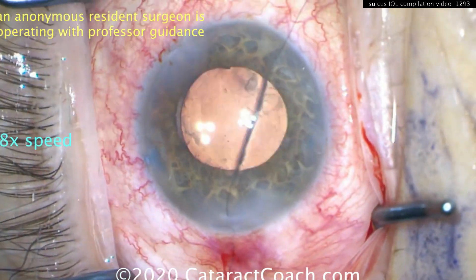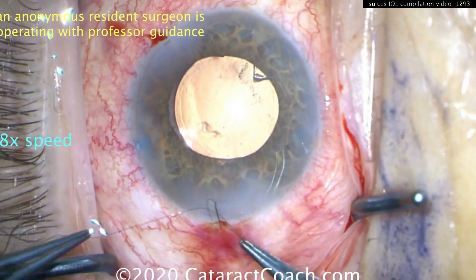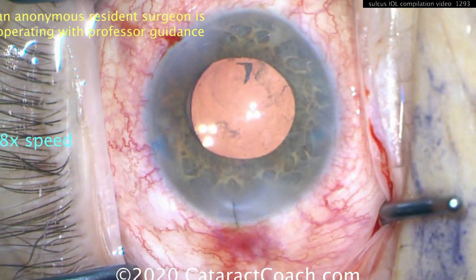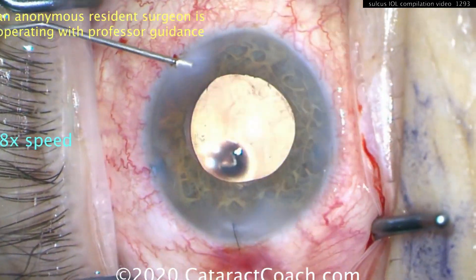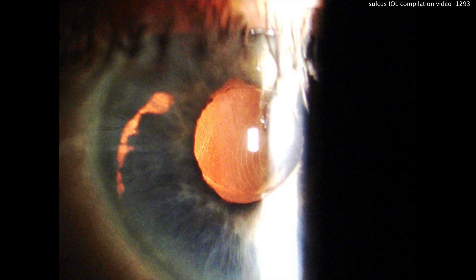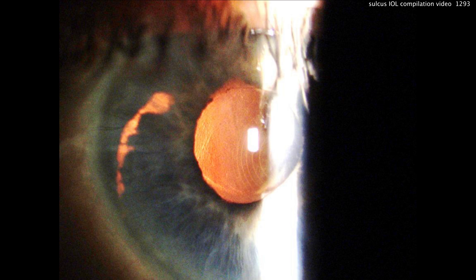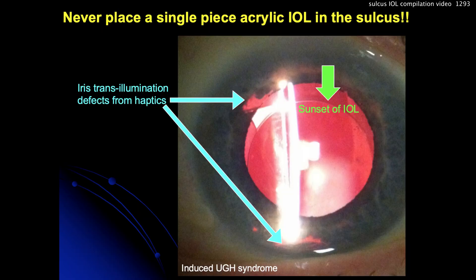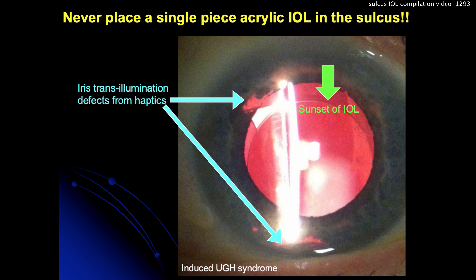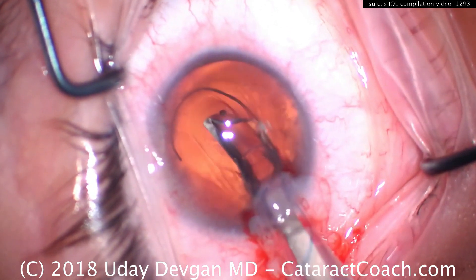With an open posterior capsule, do yourself a favor and put in a 10-0 nylon suture to close the incision. If the incision gapes or you lose IOP or the AC shallows in the postop period, vitreous can come around and the IOL can come out of the sulcus. This picture shows a bad mistake — that's a single-piece acrylic lens in the sulcus. Please, I beg you, do not ever put a single-piece acrylic lens in the sulcus: it's not meant to go there. You'll get transillumination defects, UGH syndrome, and a sunset lens.